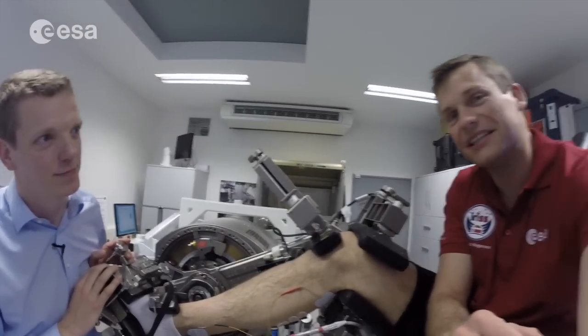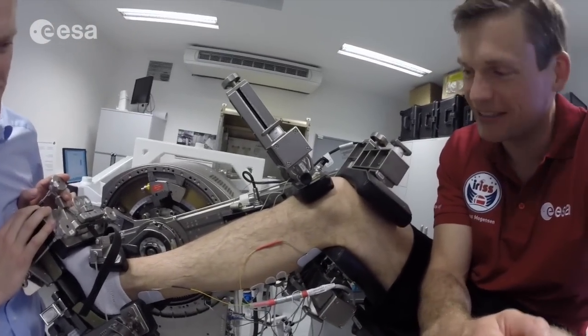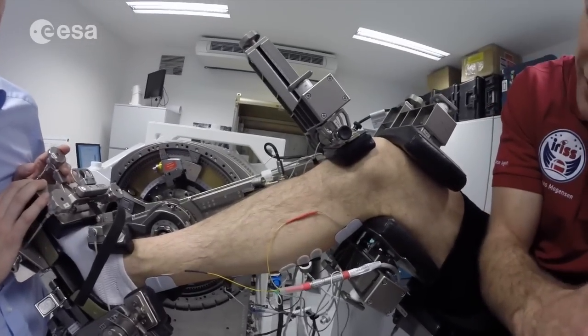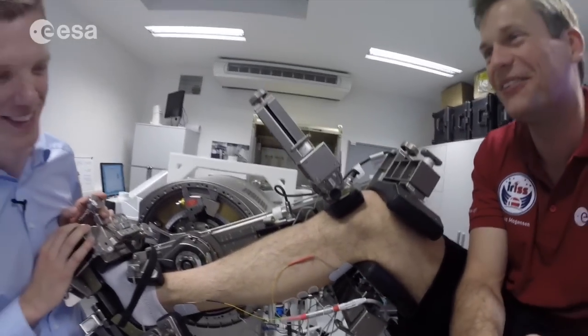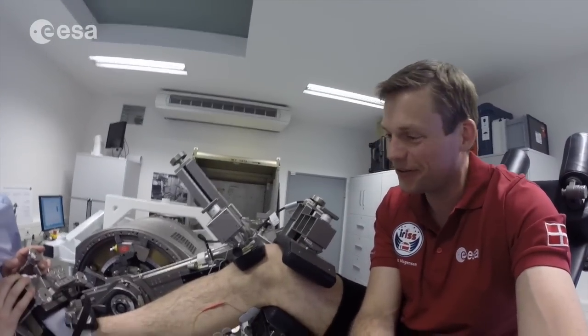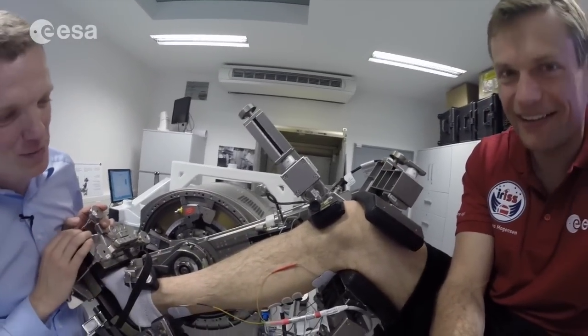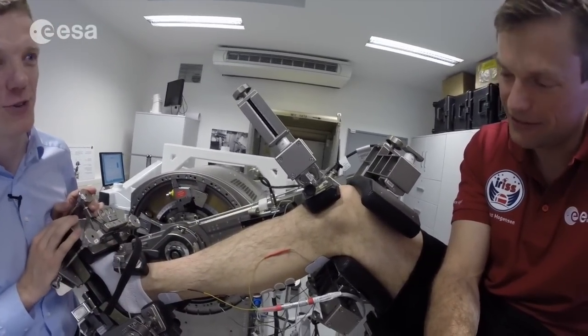As you might be able to see down here, one of the side effects of participating in this exercise is that you have to shave. I've got half a leg with hair and half a leg without hair — it's quite weird, but it's all in the name of science. We want to measure the activity in the muscle at various places, so we need a lot of measuring electrodes.